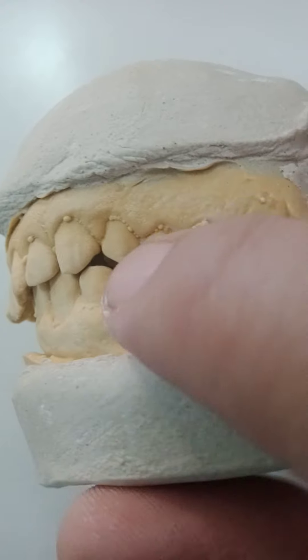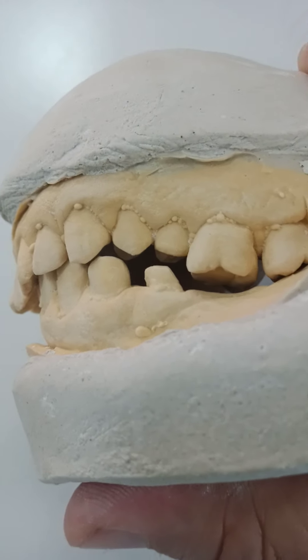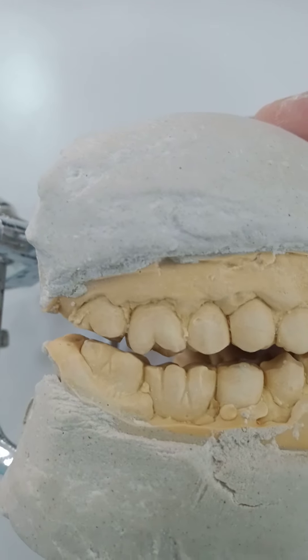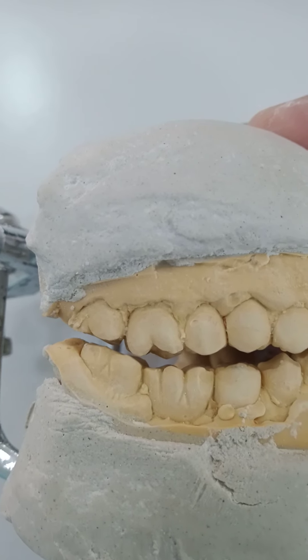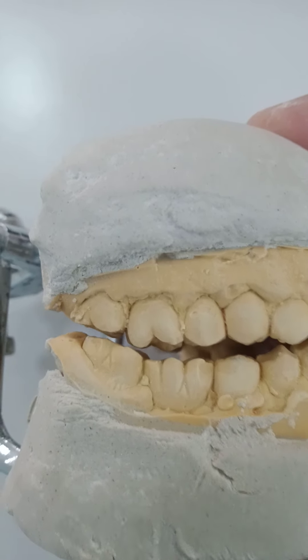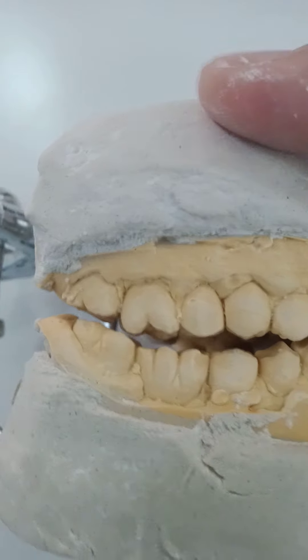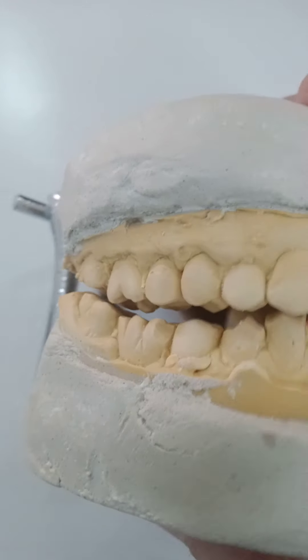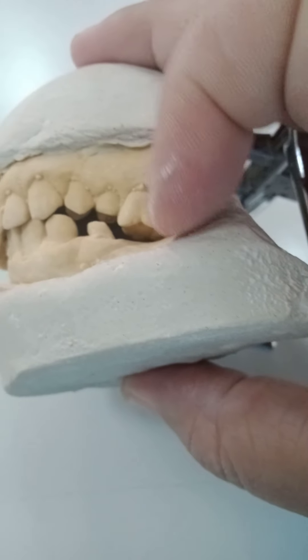There are some contacts here — these teeth are in contact. How did we know the mounting was incorrect? Because of this space: they clinically have a contact. So I advise you first to take a correct bite because it will analyze the space correctly.